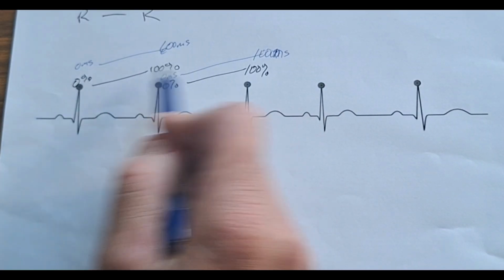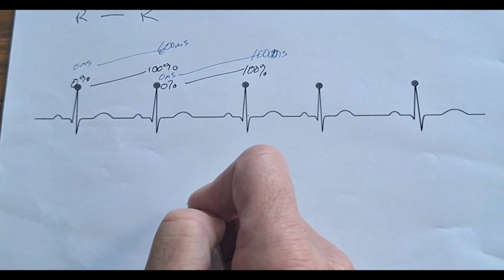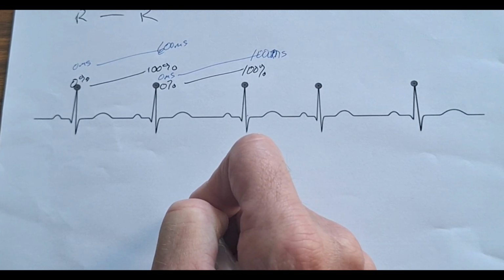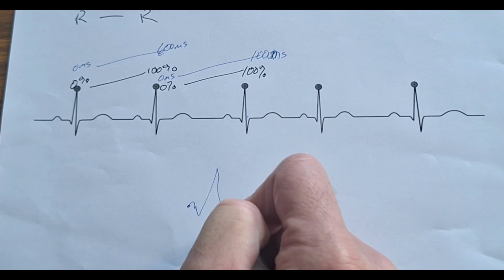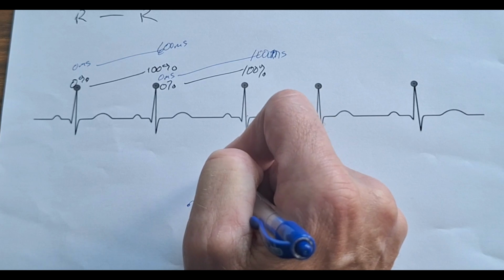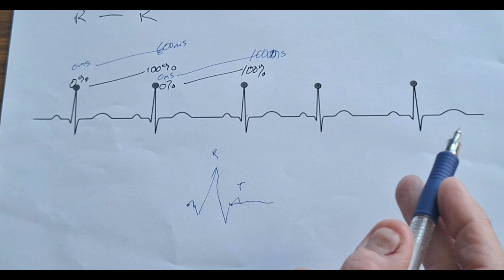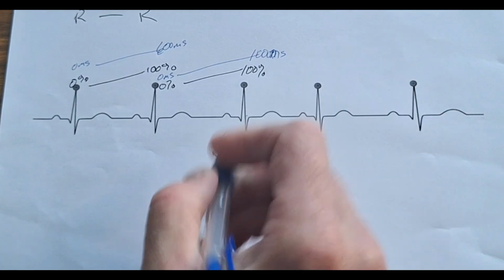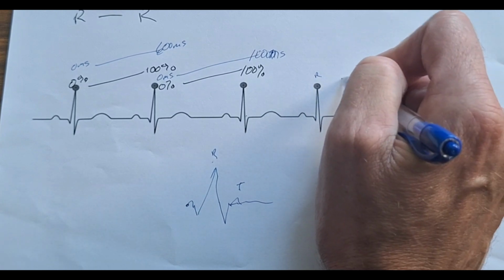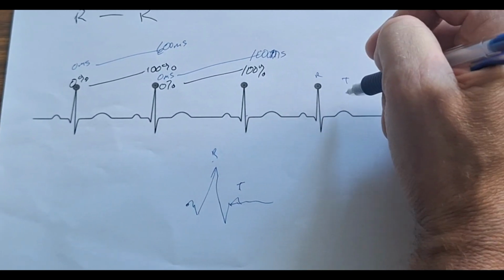All right, so here we have all this. Well, here's the difference, and this is something you really have to understand. Generally speaking, I'm going to draw a crude wave here, and really crude, that'll be my T. So this is going to be my R wave up here, and this is going to be my T wave. In time and space, generally from your R wave to your T wave, so from your R to your T, excuse me for bumping my camera, I'm high-tech here.